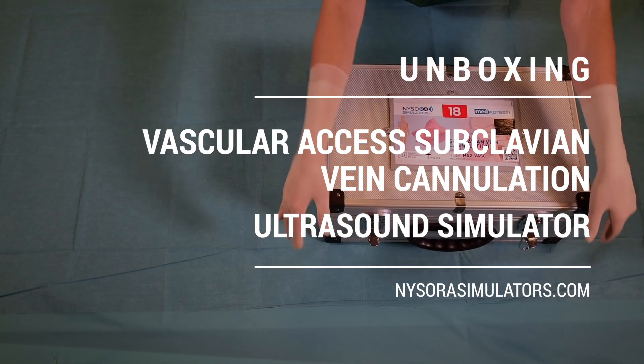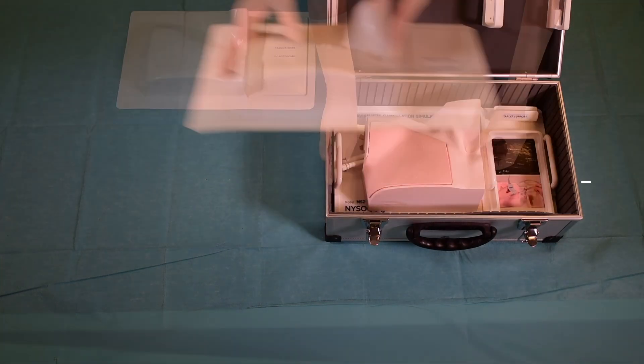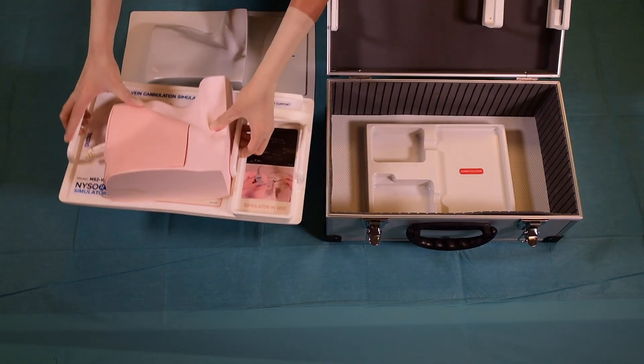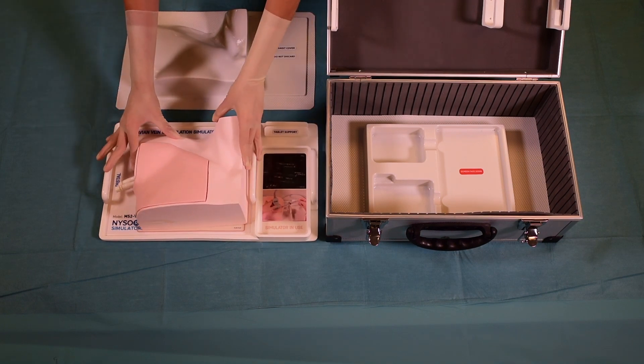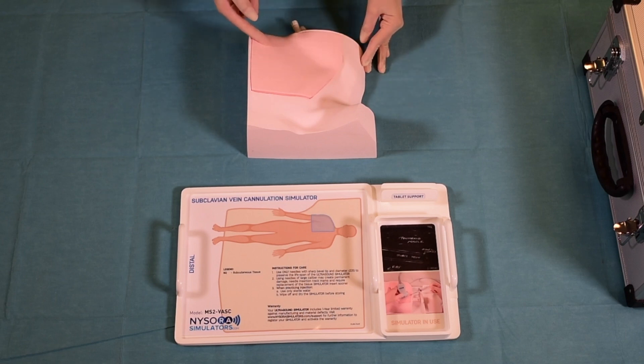Like all other NYSORA simulators, the vascular access subclavian vein cannulation simulator comes in a custom design box, which is convenient for carrying and storage. On the custom tray there are clear labels as to which part of the body the simulator belongs to.